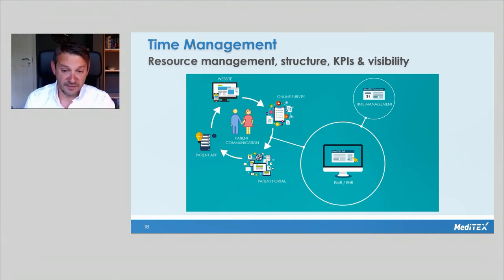The scheduler can be configured simply to cover all aspects of a patient's visit to the clinic. For example, a patient is attending for egg collection procedure at 9 a.m. The first stage of this visit could be 30 minutes in pre-admission, and then 30 minutes procedure in the egg collection theater, followed by 2 hours of recovery in the recovery room. This one egg collection appointment type can be configured to book the slots in the appropriate rooms and the appropriate doctors and nurses with one click.